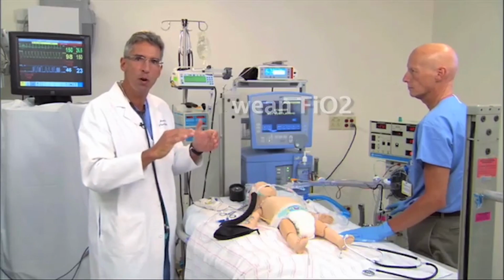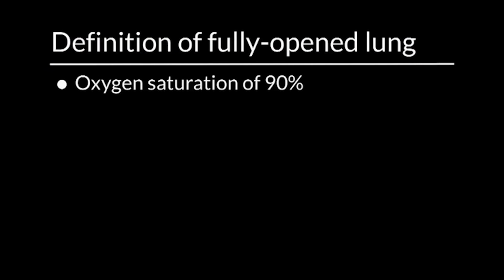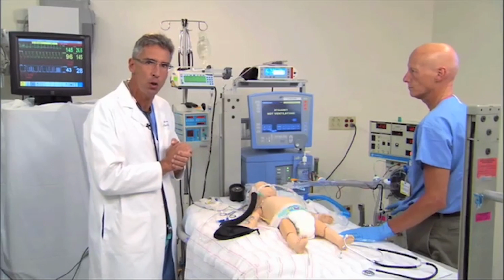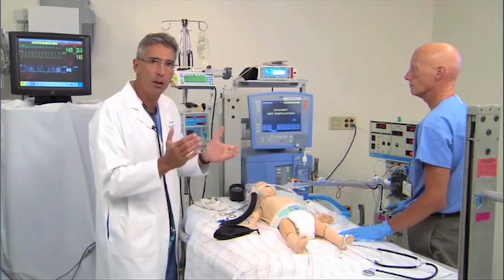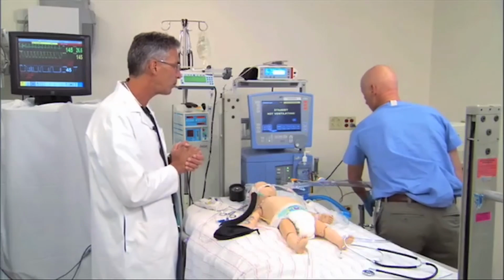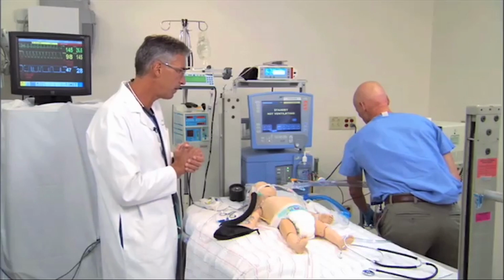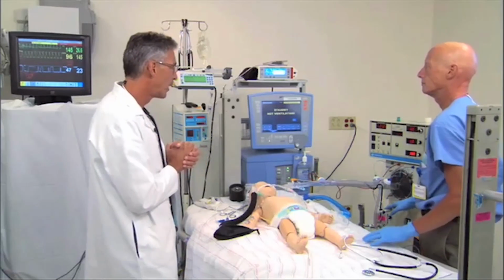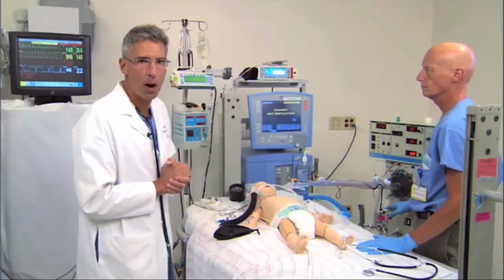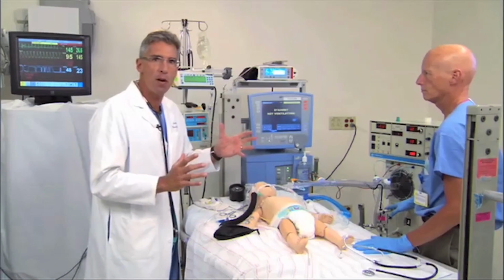We've performed a recruitment maneuver, we've demonstrated functional recruitment, and our definition of a fully open lung is a saturation of 90%, roughly, on an FiO2 of 0.6. So we're going to attempt to wean the FiO2 and demonstrate whether or not we've in fact fully opened the lung. Barry, why don't we start to wean the FiO2? I'm going to go down to 80%, John. Okay, 80%. And you often don't see a dramatic and immediate response, but again, we're trying to move along to quickly demonstrate whether or not this lung is open or not.